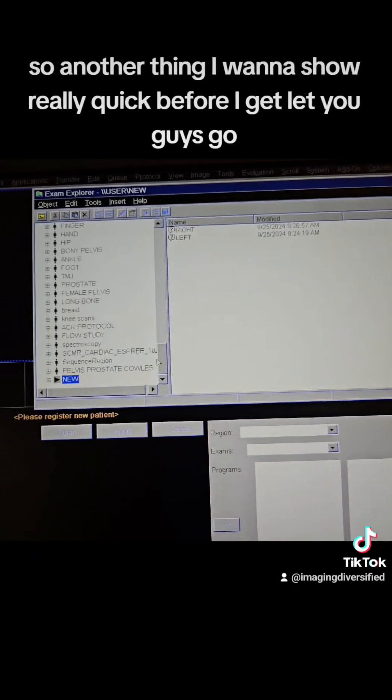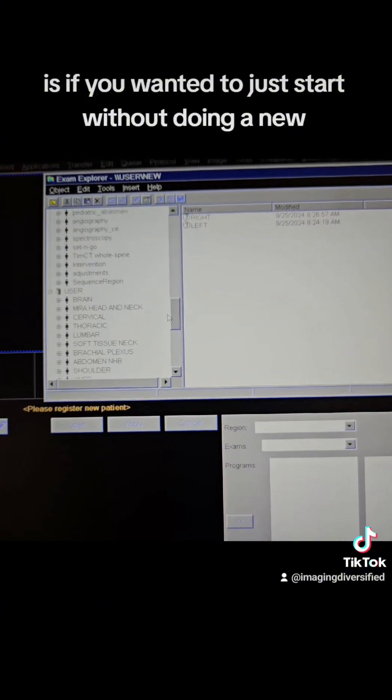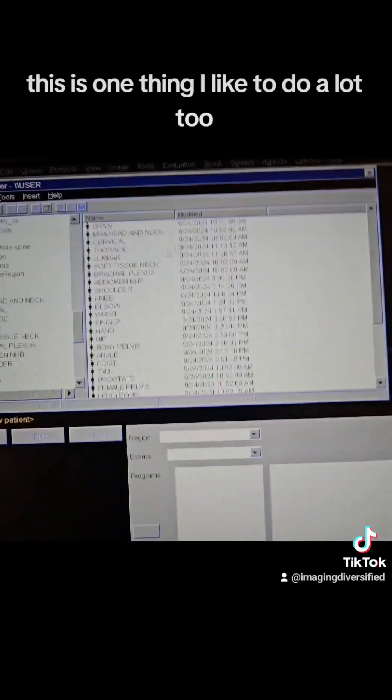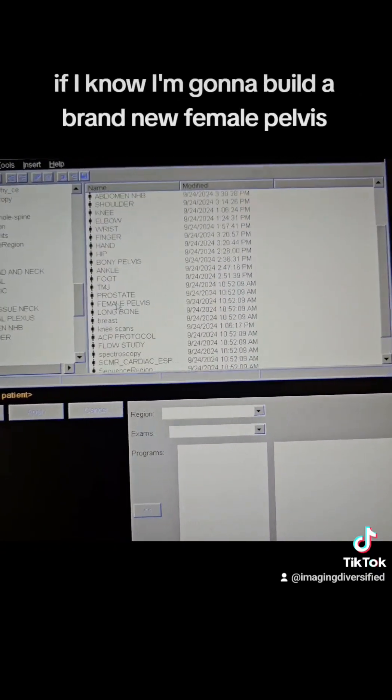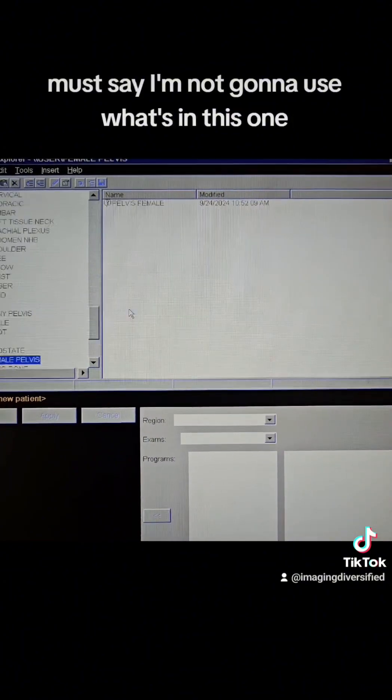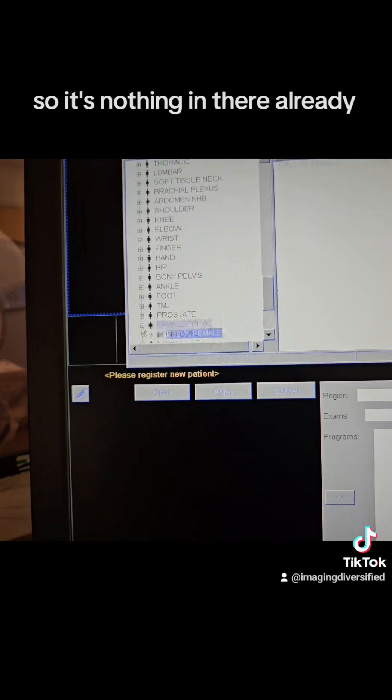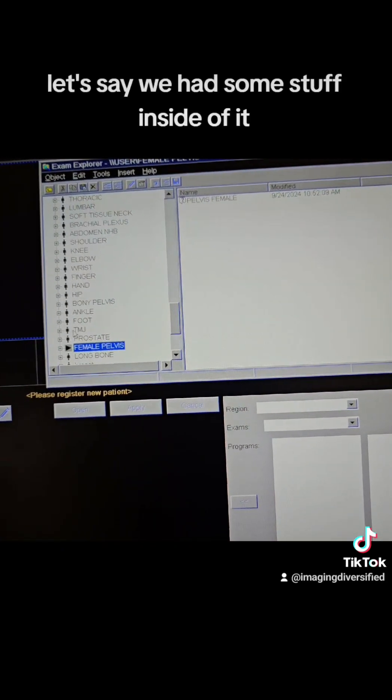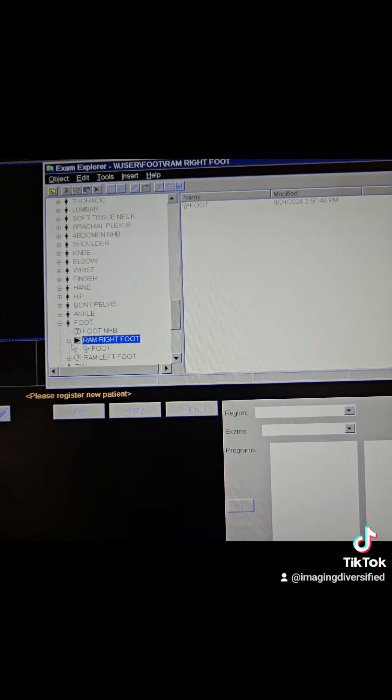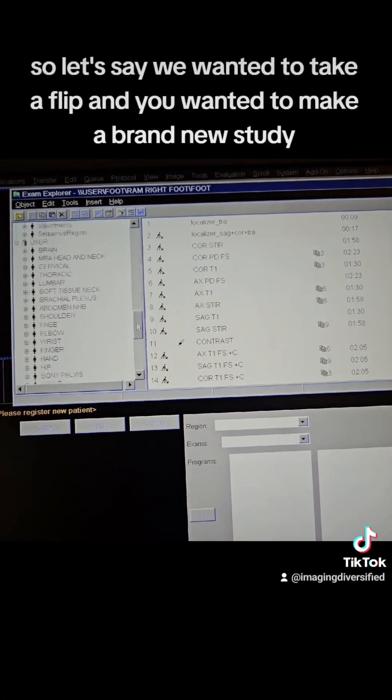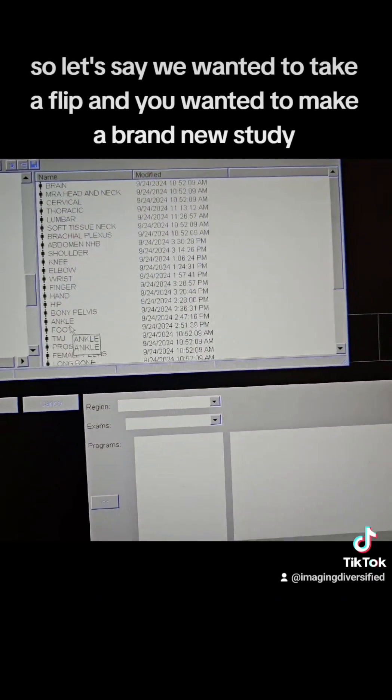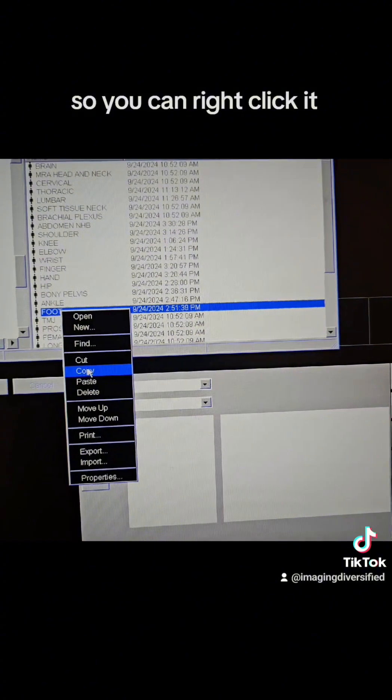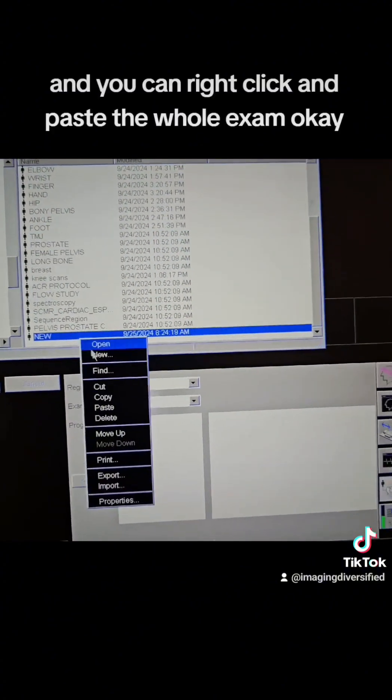So another thing I want to show really quick before I let you guys go is if you wanted to just start without doing the new, this is one thing I like to do a lot too. If I know I'm going to build a brand new female pelvis, let's say I'm not going to use what's in this one. I see what's inside of it, so there's nothing in there already. Let's say we had some stuff inside of it. Let's find something that we have. Here we go. This has stuff.